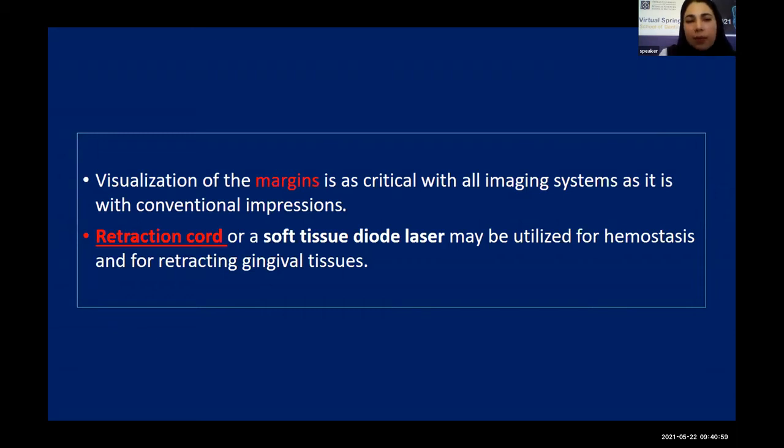The same as conventional impressions, visualization of finish lines or margins is critical, and using retraction cord in order to retract gingival tissue is essential.